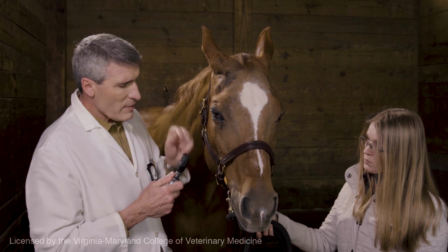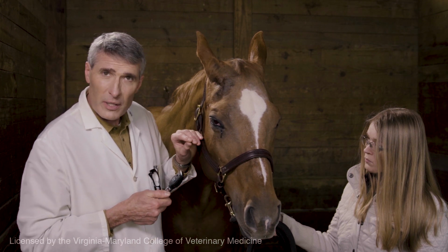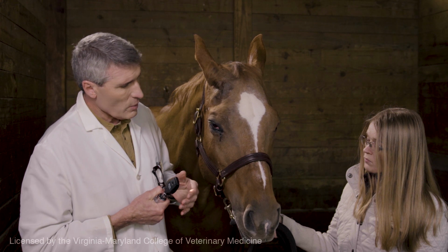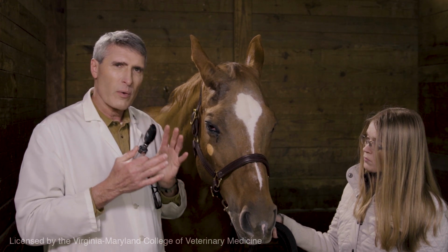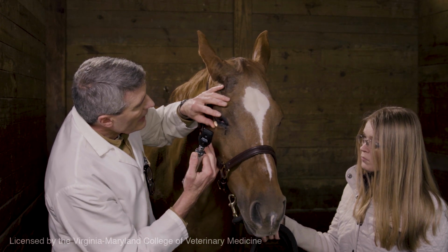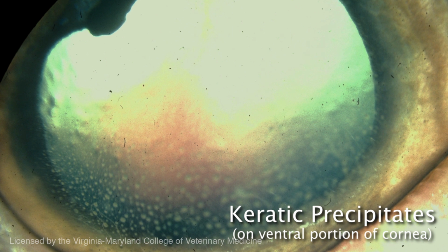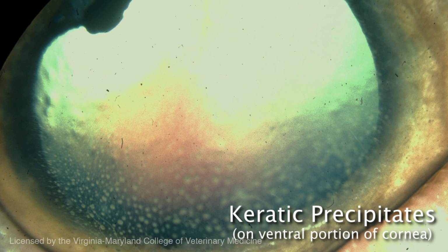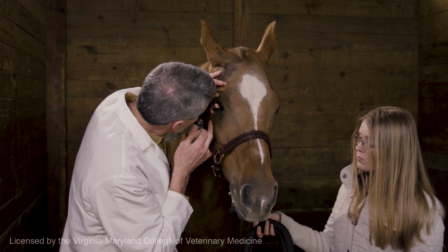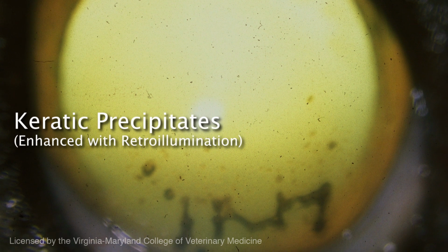If I wanted to look with even more magnification, I could even turn this up to 20 diopter. Now 20 diopter is going to focus at 1/20 of a meter, or 2 inches. So if you were looking for little tiny fine keratic precipitates from a horse that has uveitis, and you want to look at the bottom of the eye and see those little bitty tiny dots that are so important diagnostically, this is how you would do it. You can see that I'm really, really close to the eye, and things are really, really magnified. Okay, so that's how you would use your direct ophthalmoscope to evaluate things.